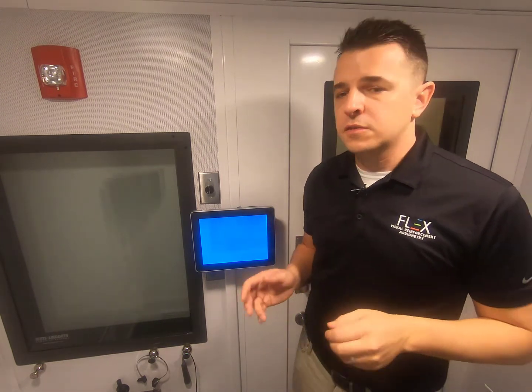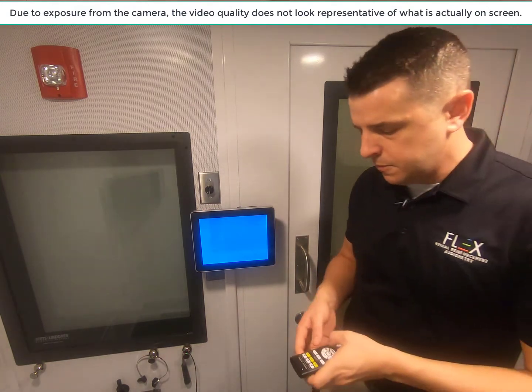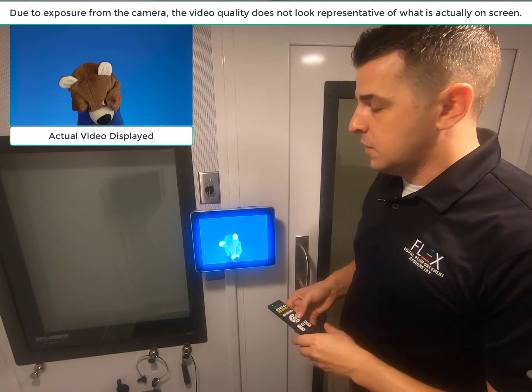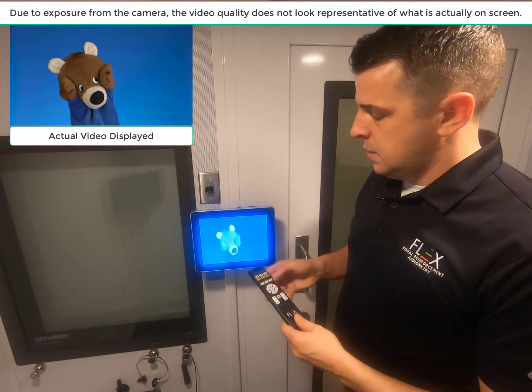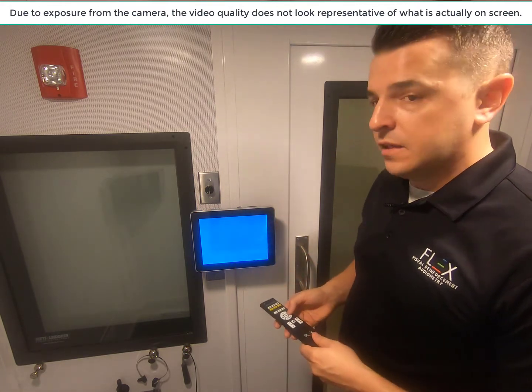So let me go ahead and show you what that looks like. Here you have our 10-inch Flex Basic monitor, and I'm just going to go ahead and activate it. So this is our traditional stimulus with no animated light border. Then I'm going to press the yellow button below the toy and activate that light border.